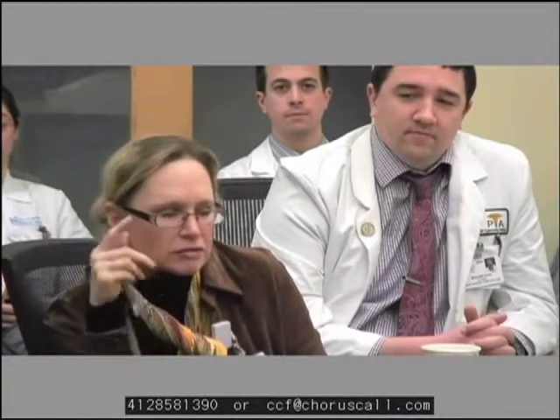You mentioned the margin probes, and there are a number of them, and I'm quite familiar with the data coming out from that technology, and it's not tremendously helpful. Part of the reason is a point that you touched on, which is that it doesn't characterize the tumor cells for us.